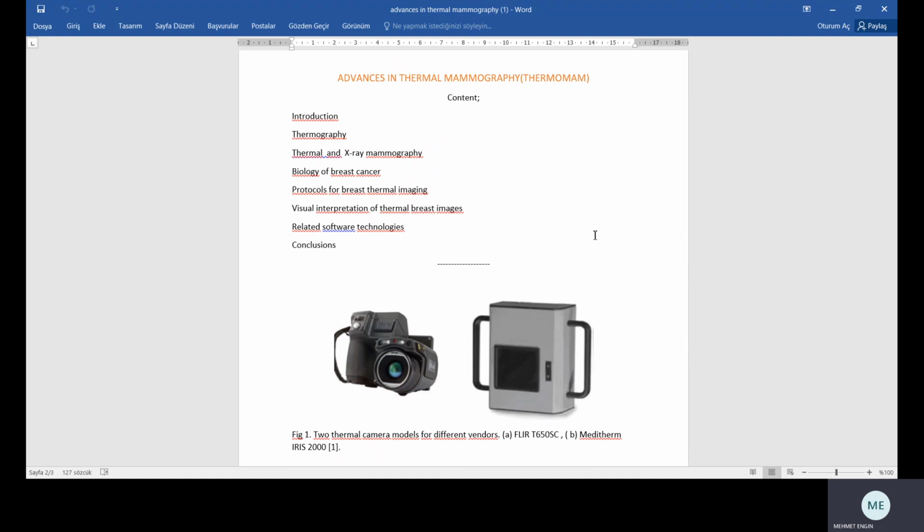Visualization tool for thermal interpretation. Given that a thermologist has to look at 5 colored images where the temperature differences between neighboring regions need to be identified by minute color variations, interpretation of thermal breast images is a huge cognitive overload and very error-prone.